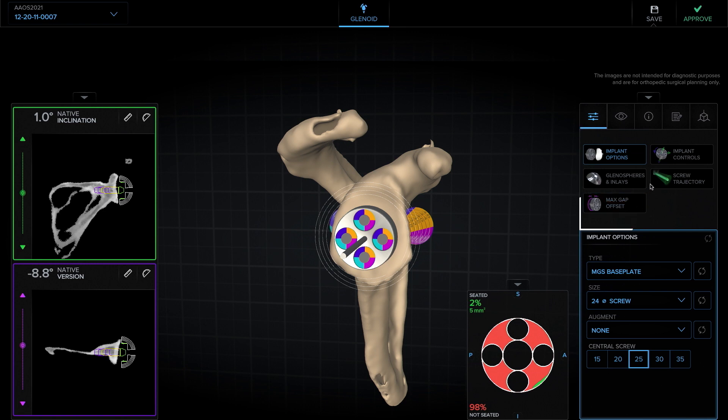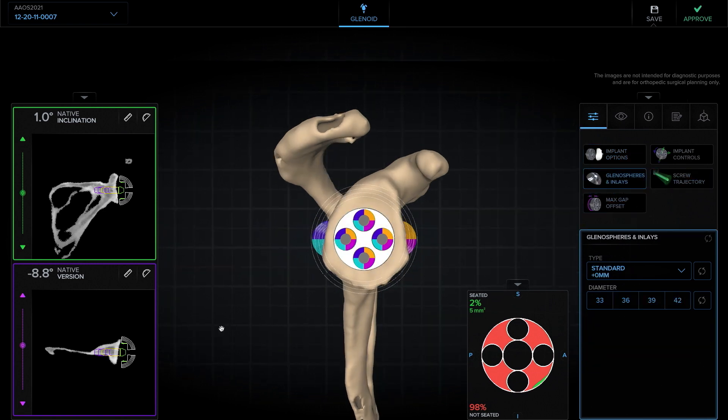Next, I like to size the glenosphere. I typically will choose the glenosphere on this axial view, making sure that it covers both anterior and posterior, at least flush anterior and posterior. This looks about a 36 and that seems to cover pretty well.